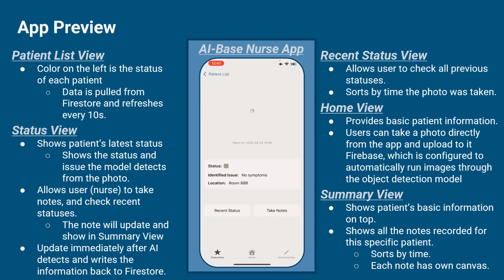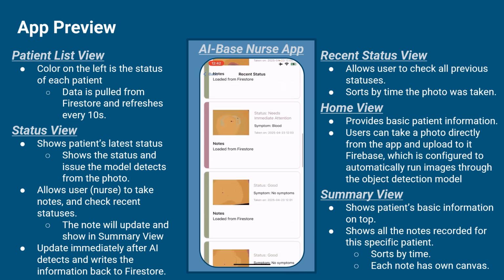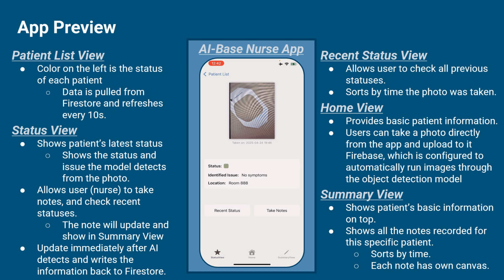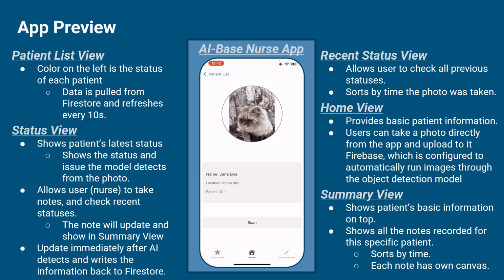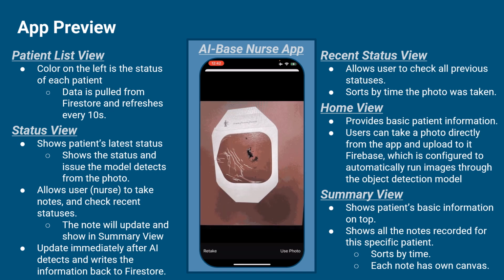Now that we automated the monitoring of the patient's dressing sites, we need a way to alert nurses so they only need to act when necessary. Using Xcode and Swift, we developed an iPhone application that can be downloaded on a nurse's cell phone and can be used to quickly check on a patient's status, information, and even trigger the camera to take a picture at any time they want.